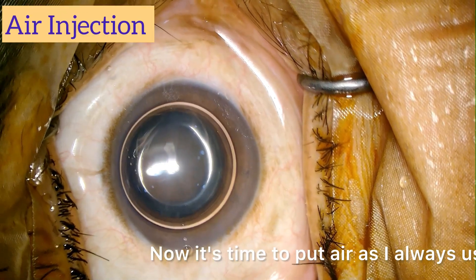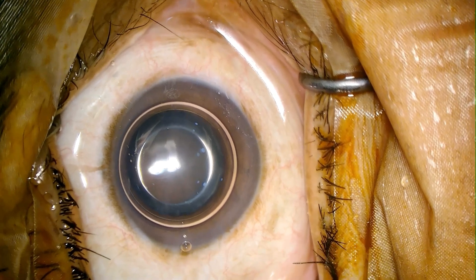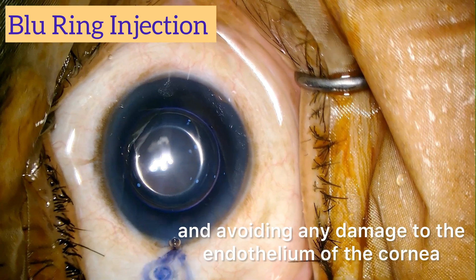Now it's time to put air, as I always use before putting the blue dye to stain the anterior capsule properly and avoiding any damage to the endothelium of the cornea.